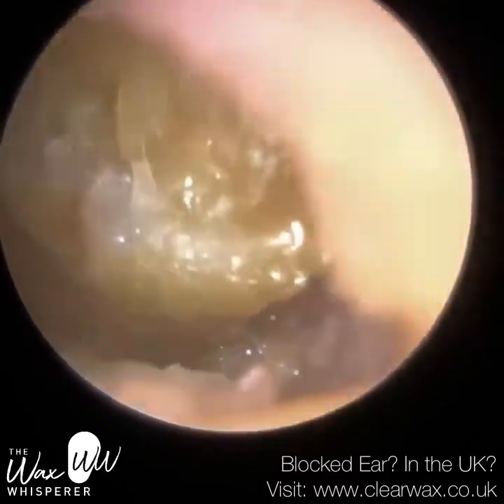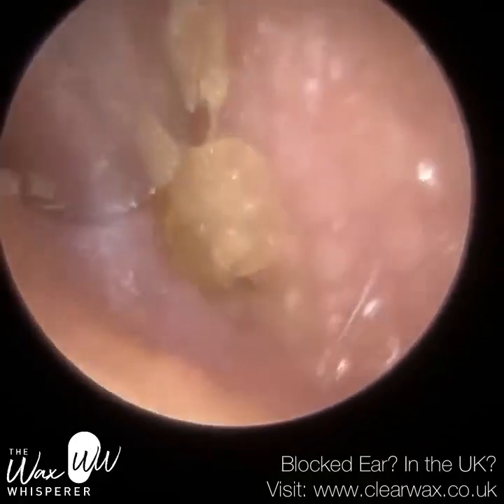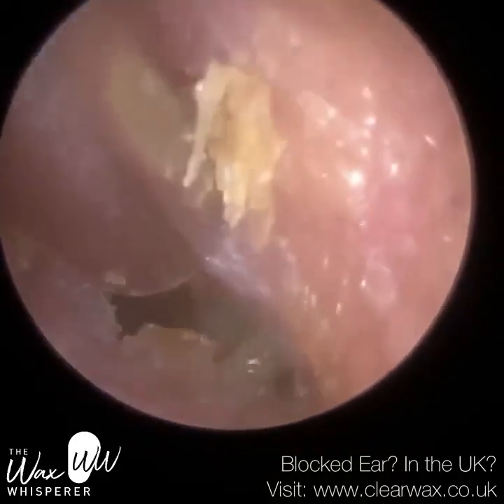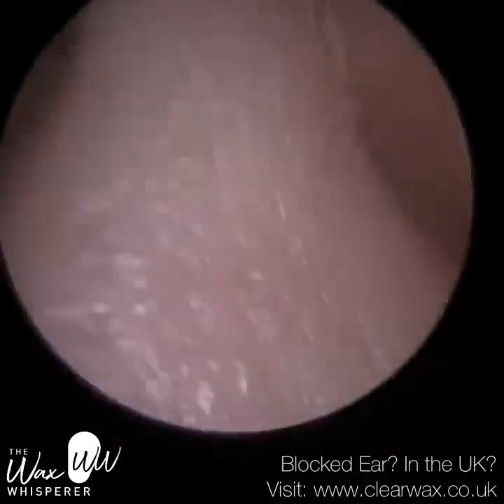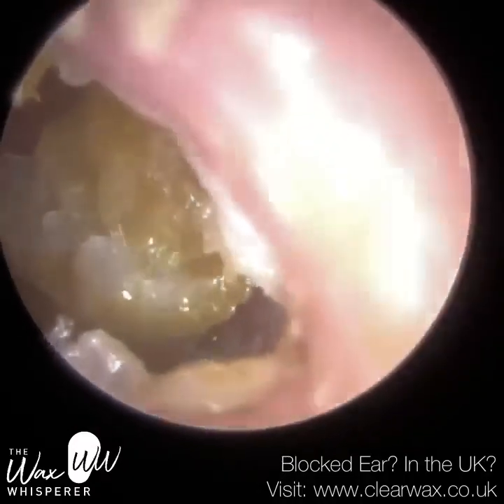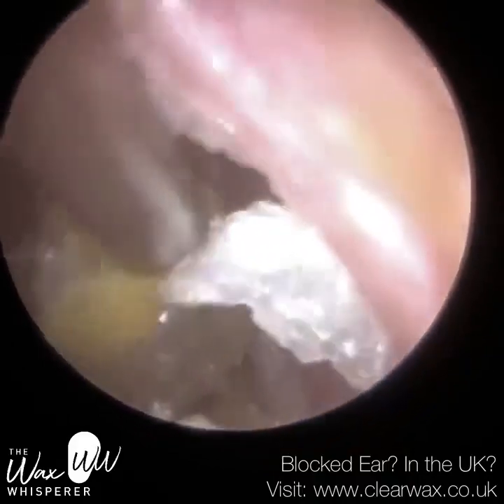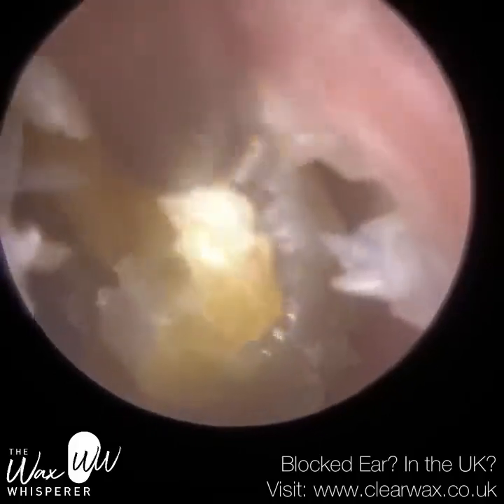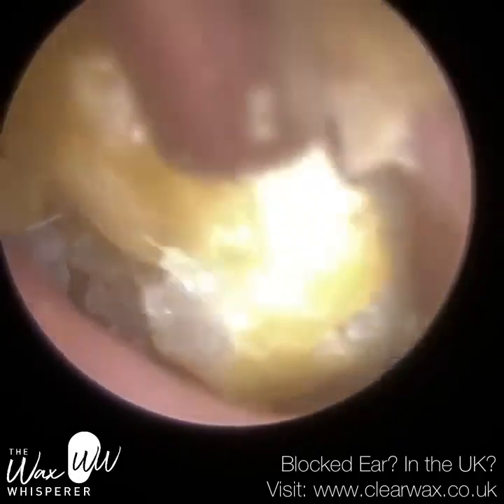And what happens in this case is that because of the eczema, because of the dry skin that dies, it doesn't migrate and it collects in the ear. And you can see here I'm having very much difficulty in inserting the suction tube even through the ear canal. So because this patient's got a lot of edema, swelling as well of the ear canal due to their otitis externa, it's just a build-up of excess fluid within their cells in the auditory canal walls, which causes the ear canal to be swollen, and we call that edema.